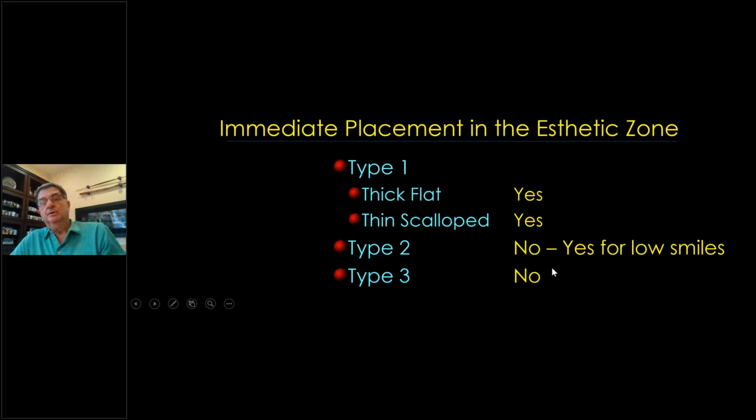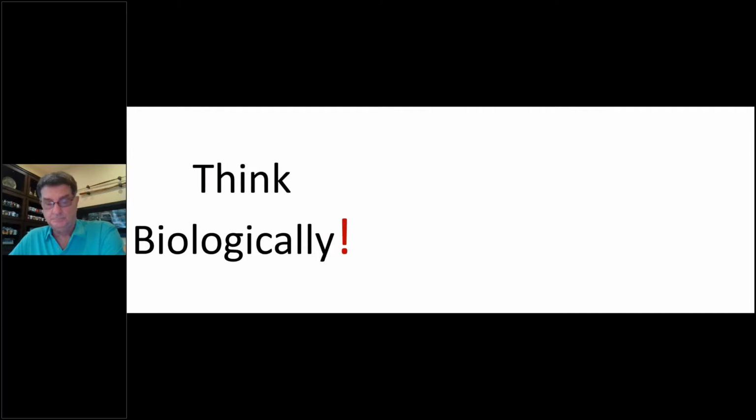So really, this is the kind of summation. Type 1s, go ahead, gung-ho. Type 2s, much more questionable, especially with the highest smile lines, because you're never sure exactly where that tissue will wind up. But you see, by grafting the gap, we keep the tissue out, and I showed you an evidence-based approach to everything that we did, step by step, research, thickness of tissue. It shows you everything with 4 to 6 year data. So we always have to think biologically. All my students know that that's the only way that they can walk into my room and to school.